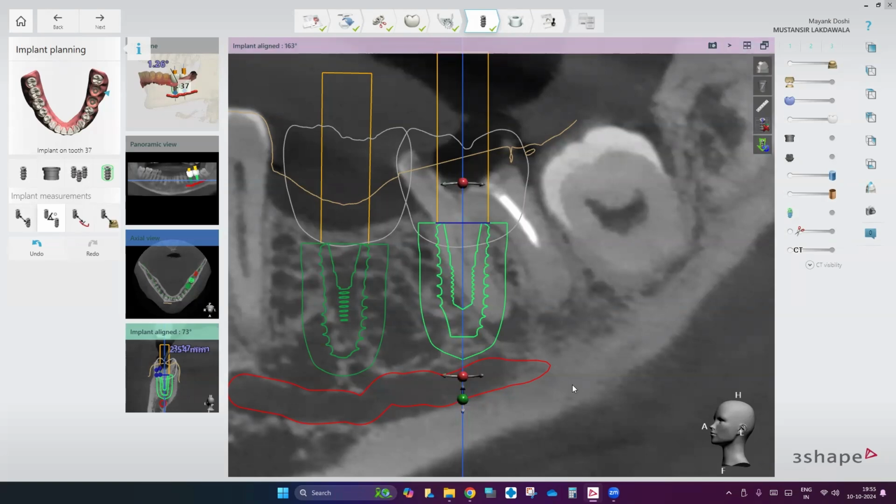When we give virtual implant planning, we put an implant in the furcation. In the furcation, exactly what I was discussing, that the conventional ways of placing implants were taught, the path or that inclination. Continue. Hello. I thought because I lost your voice in between, that's why I started talking. Please continue, Dr. Dipali.